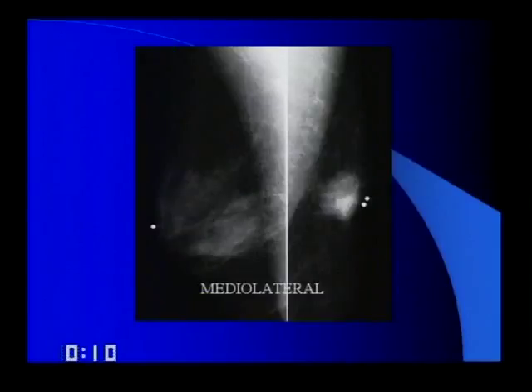And there is parenchymal density in the retroareolar area of the left breast. Okay, and this is marking his palpable abnormality. The nipple is down here on the left, so it's in the upper outer left breast. This is compatible with gynecomastia. Okay, on the left, gynecomastia.